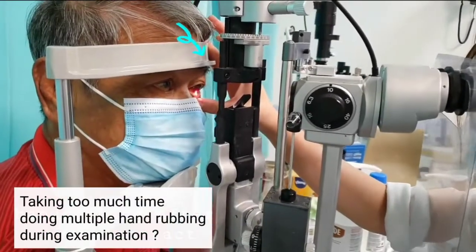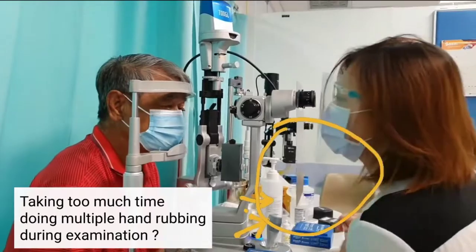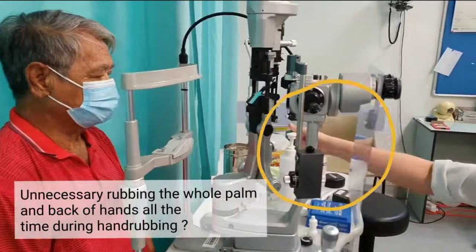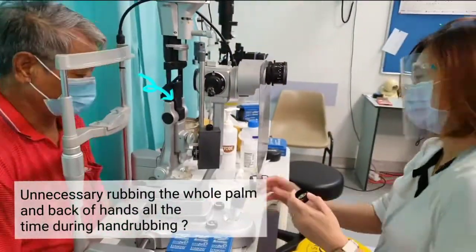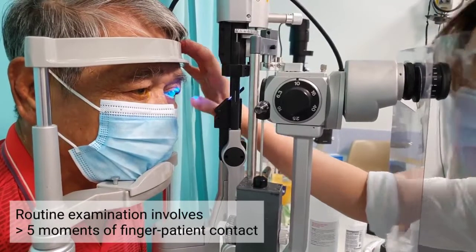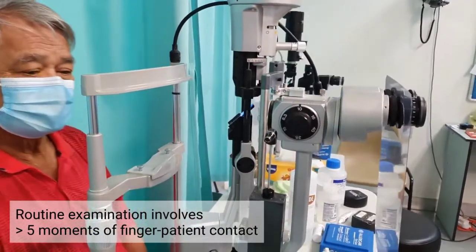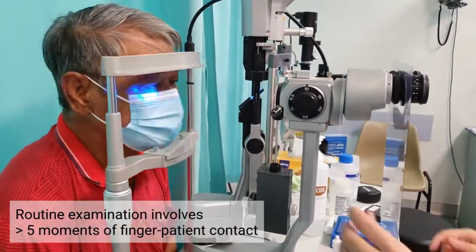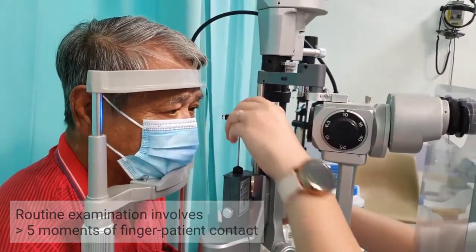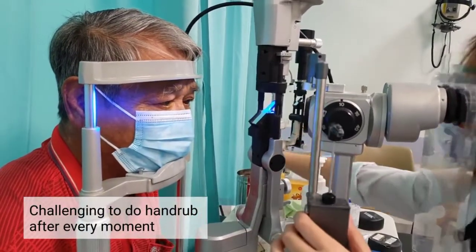During this COVID-19 era, do you feel you are taking too much time doing multiple hand rubs in between slit lamp examination? Do you feel you are unnecessarily rubbing the whole palm and back of hands all the time during hand rub? Doing hand rub can be tedious during slit lamp routine examination, especially when you need to meddle with so many knobs on the slit lamp. Routine slit lamp examination could involve at least five moments of finger-patient contact. It's challenging to rub after touching the patient every time.